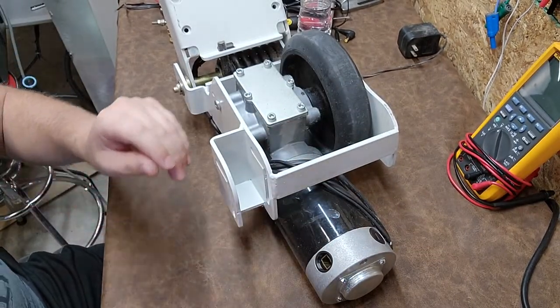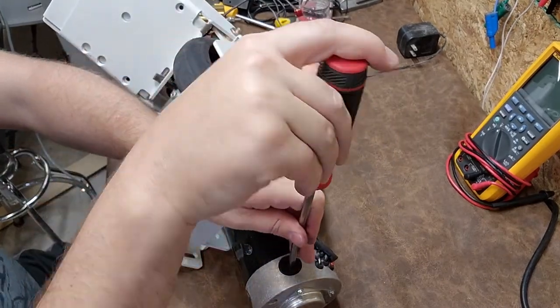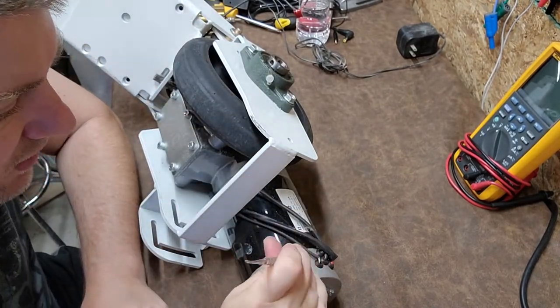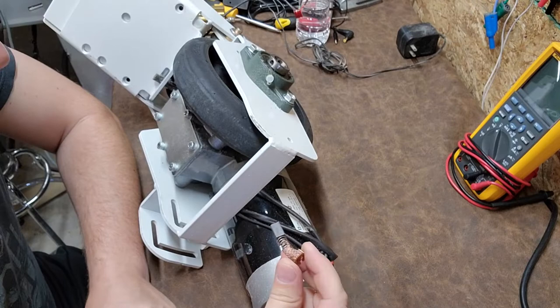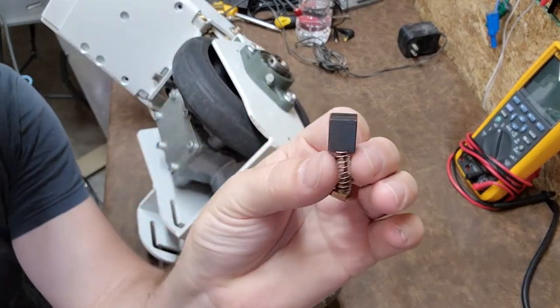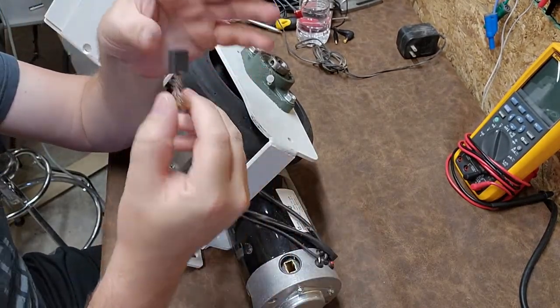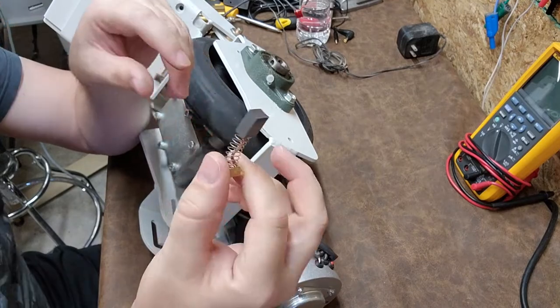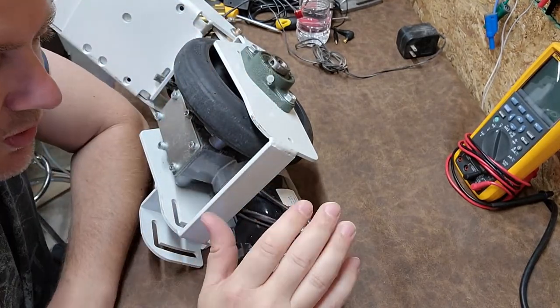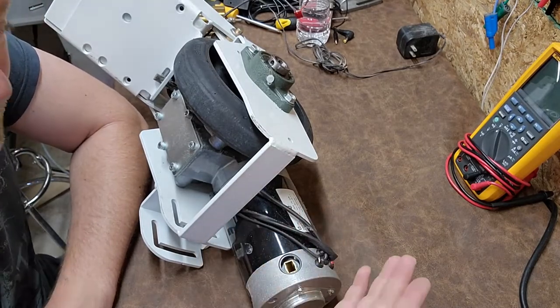Even though this brush is fine, the other ones might not be. All it takes is one brush to go bad and it's going to affect your entire system. These are good, these are absolutely fine - look at that. When you do a lot of wear and tear on these motors, the brushes are consumable and these parts can be changed out.